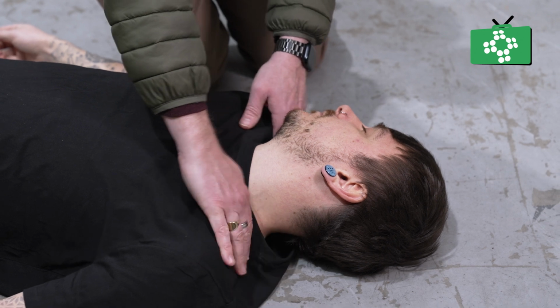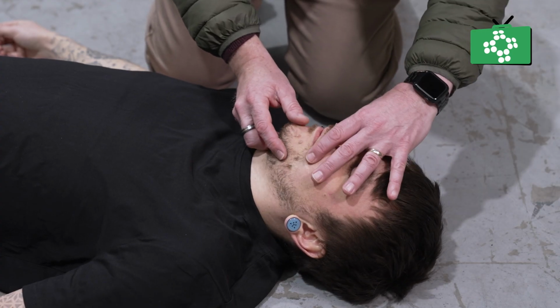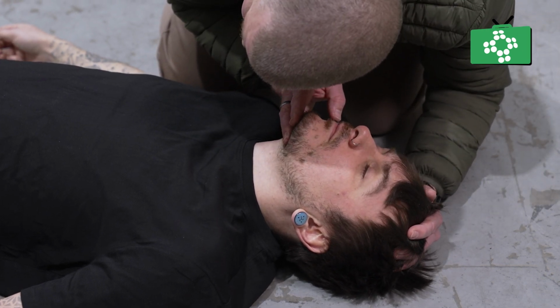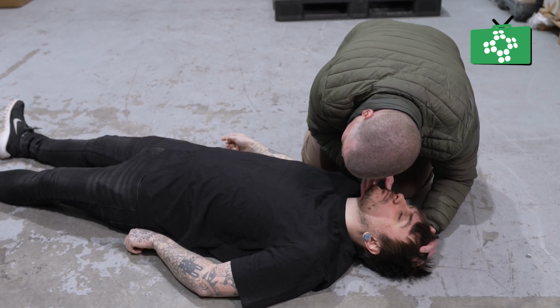Try and get a response by speaking loudly and gently shaking their shoulders. Open the airway, check for obstructions, and do a breathing check for 10 seconds. If they're not breathing or breathing abnormally, begin CPR immediately. At this point, someone should call the emergency services.